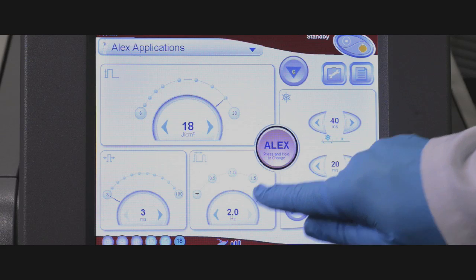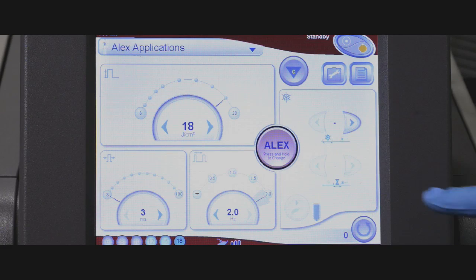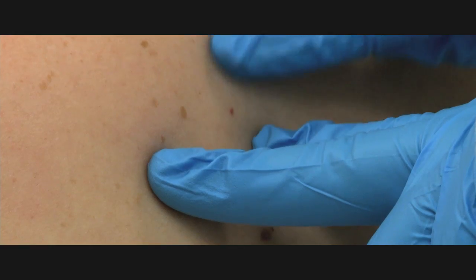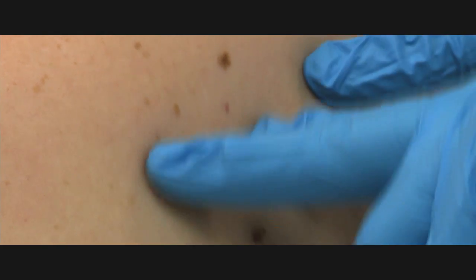When using the painting technique, first be certain to test a small area in order to check the response of the skin and the lesions before proceeding. If there is no adverse response to the non-pigmented skin, the treatment can proceed.